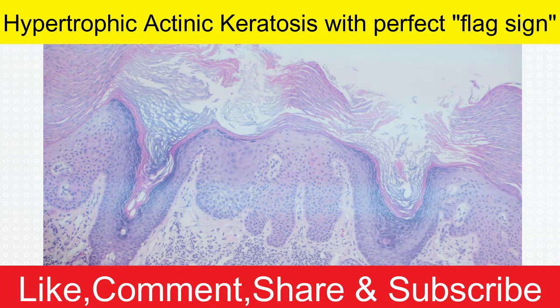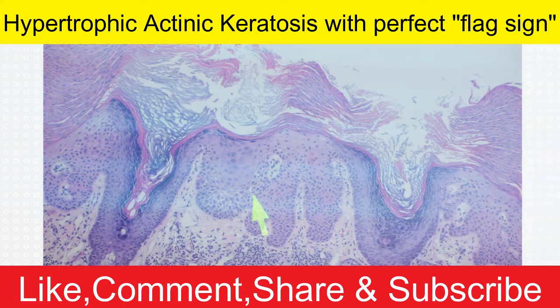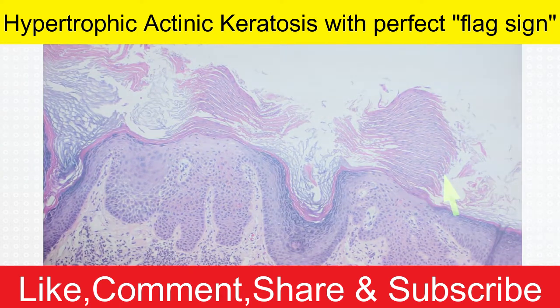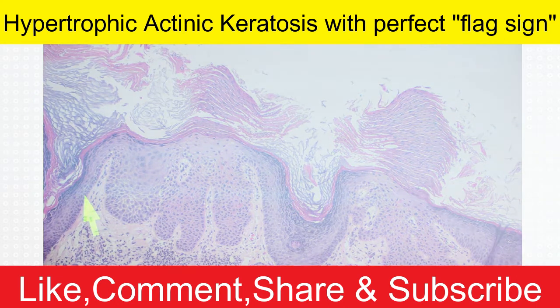And if you're a beginner to dermpath, parakeratosis means nuclei that are retained in the corneal layer. Normally the stratum corneum is loose, flaky, dead keratin without any nuclei, but the nuclei are retained here. The reason that happens is that parakeratosis is a sign that the epidermis is growing too quickly. Normally cells go from the basal layer up to the top of the epidermis and then die and turn into the stratum corneum. That normally takes about 28 days, give or take.